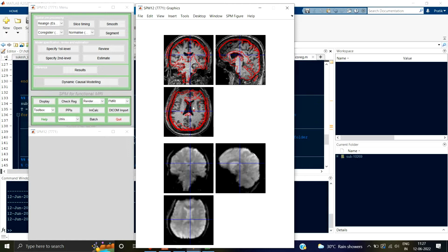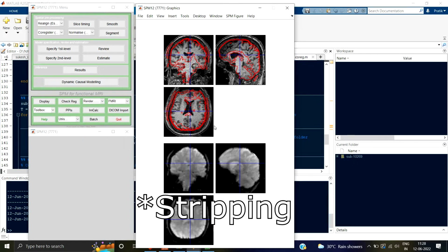So this may be difficult if you have a lot of subjects. Say if you have 100 or 200 subjects, then it will be very difficult to check the co-registration output of every subject. In that case, what you can do is something known as skull stripping. By skull stripping, the skull of the anatomical image is removed.